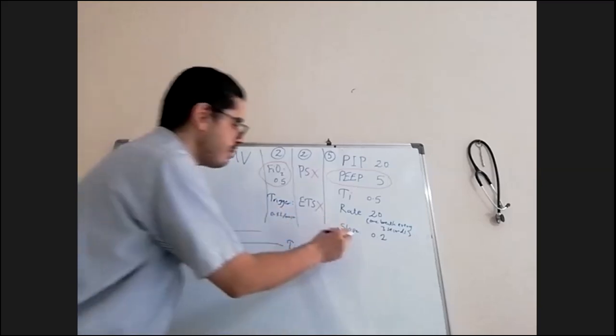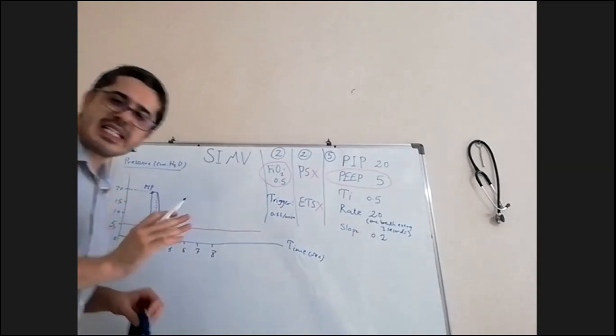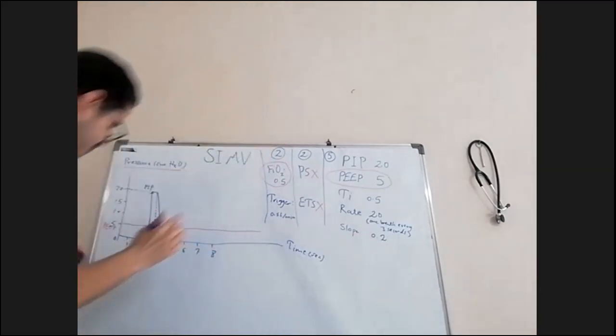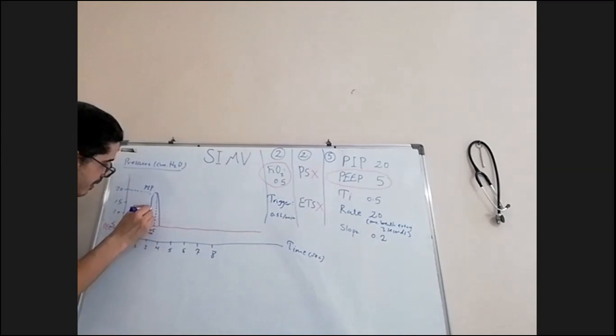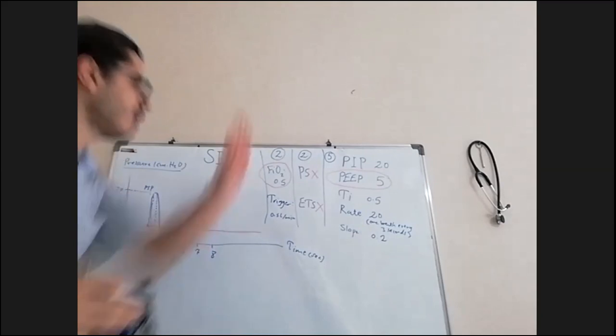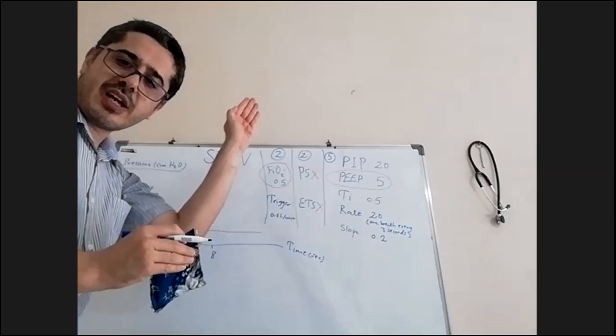Where is the slope? The slope is here. How it is going up, so it does not go straight. It goes slightly oblique. This is the slope, so the angle here is the slope. Instead of going one straight, it goes in an oblique direction.